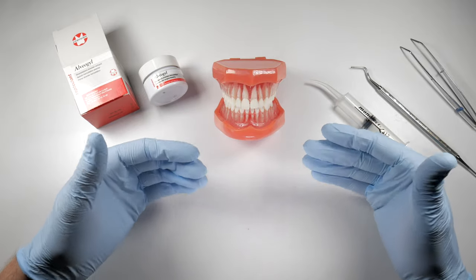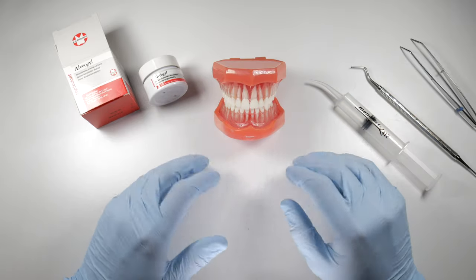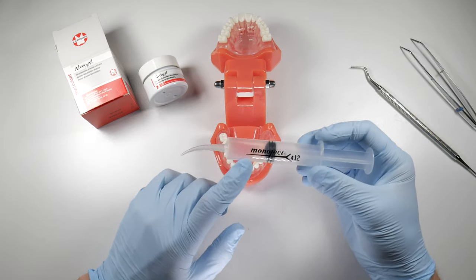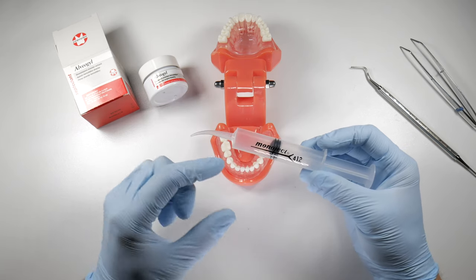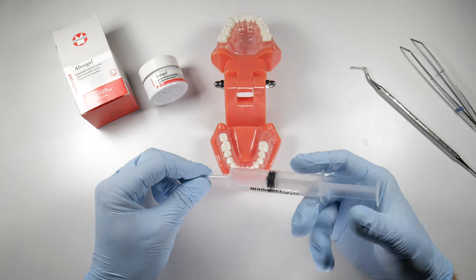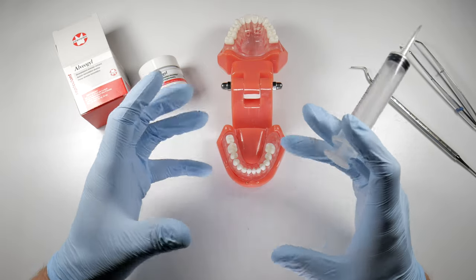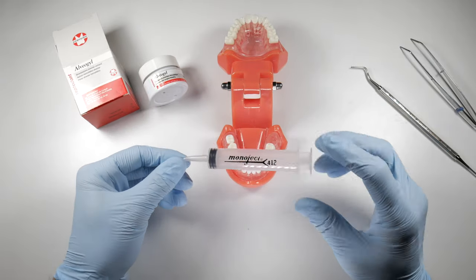I tell them what we're going to do to treat them and when it's going to get better. The treatment we do is to irrigate the site. Let's say we took out a lower second molar — we're going to take our Monoject syringe, which we've prepared with a 3% peroxide solution at about 20–25% of the mixture and 0.12% chlorhexidine in the remaining 75%. We irrigate and flush down into that socket, and the peroxide will contact the tissues, bubble up, oxygenate the area, and lift out any debris.